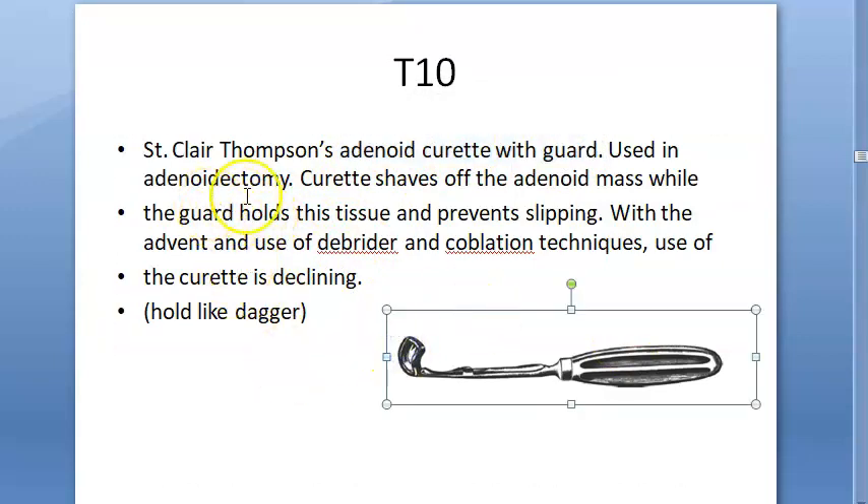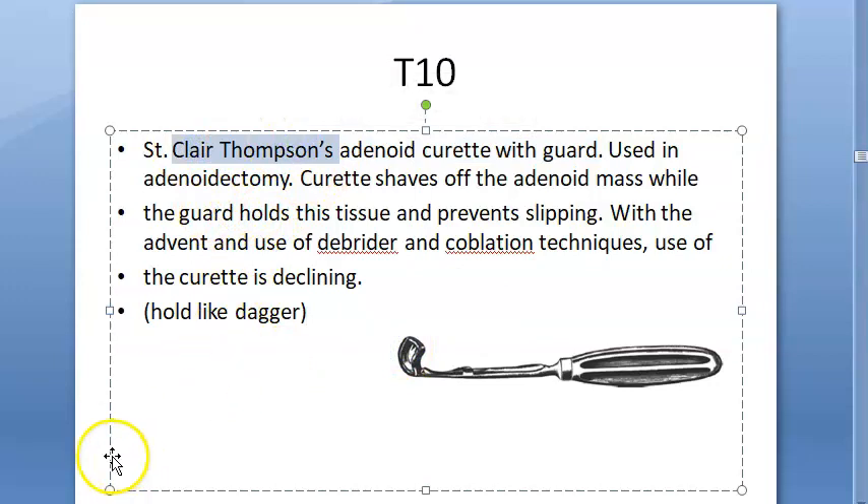This is the Saint Claire Thompson adenoid curette. They don't use this much anymore — now they are using the debrider, coblation, and other new techniques. Coblation uses sodium chloride plasma. Remember this is the Saint Claire Thompson adenoid curette.